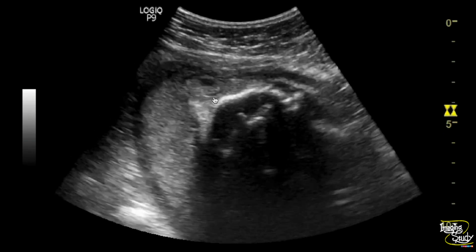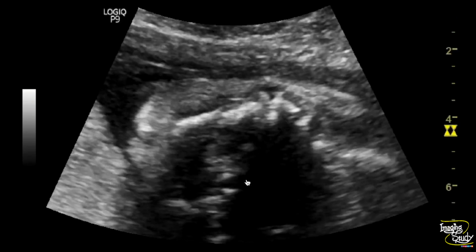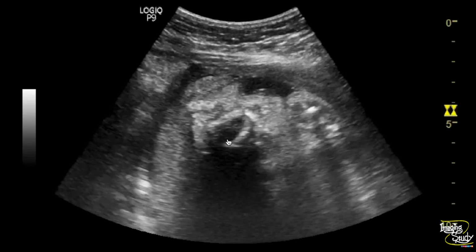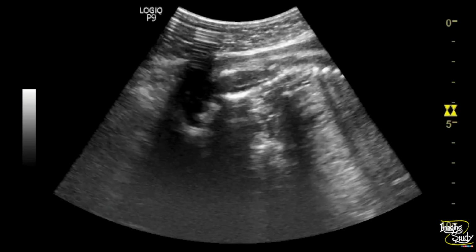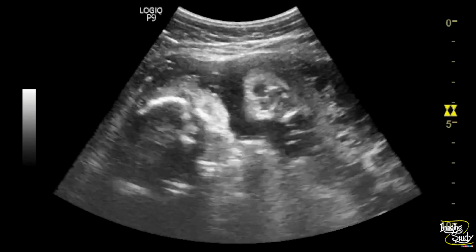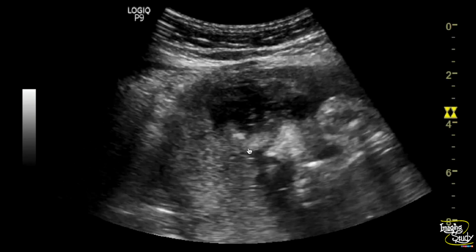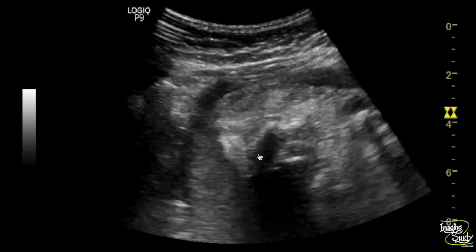Now when we are looking at the fetal head, you can see some irregularities over the facial region. So there might be something soft tissue abnormality at that part. We want to understand the anatomical structures first here. Here something soft tissue is noted, which looks like some fingers. Here you can see the fetal lip, so we are at the mouth region. So let's jump into other parts. Here is the nose region. You can see this soft tissue area.